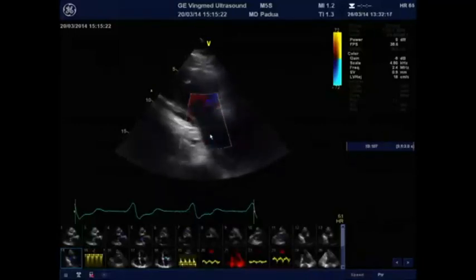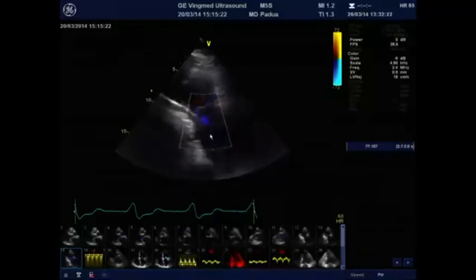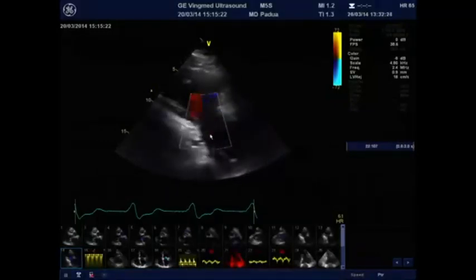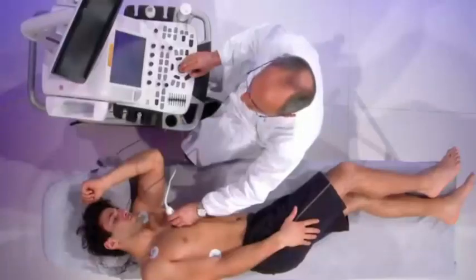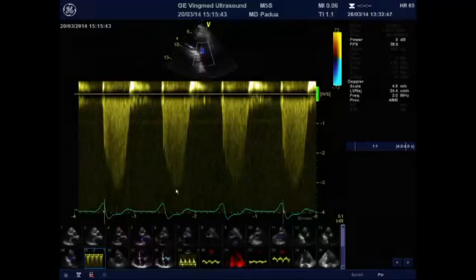Not only should the tricuspid regurgitation be checked in terms of color to look at the complications of biopsies, but it is also very useful to sample the tricuspid regurgitant jet with continuous wave to obtain the maximum gradient between the right atrium and the right ventricle to derive the pressure in the pulmonary artery. This is, again, an important parameter to monitor.